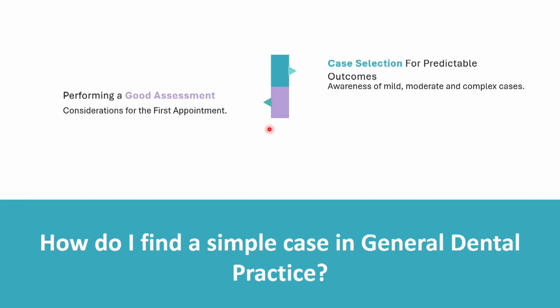So that was just a little idea of what complex or moderate cases actually look like. That process of selecting a case is actually made easier if we perform a good assessment. You cannot decide if a case really is mild, moderate or complex from photographs alone. You have to do a good assessment, and it's the foundation of your case actually.